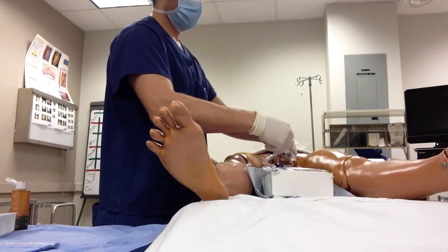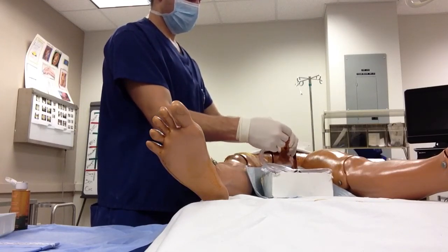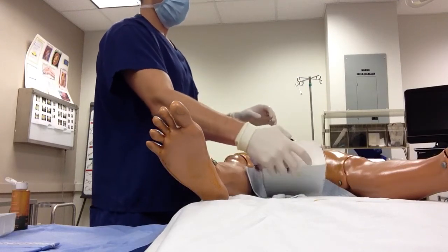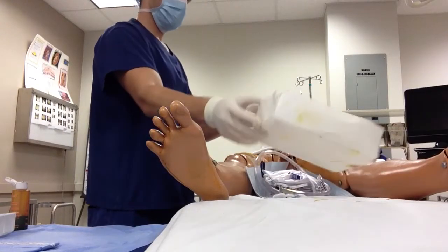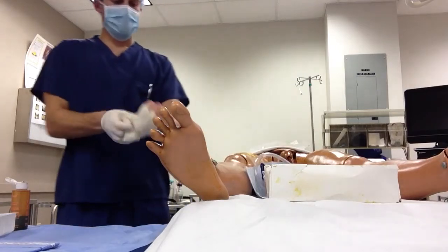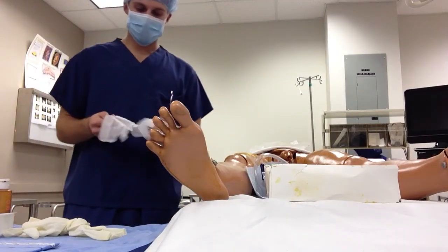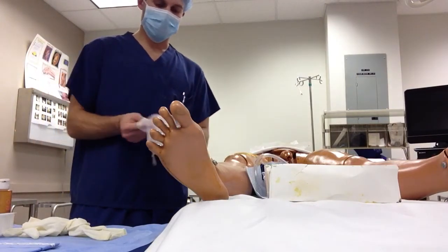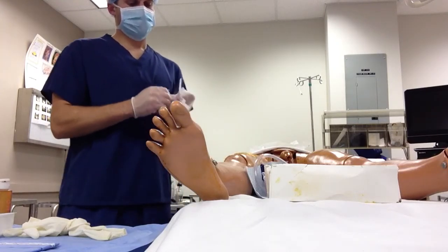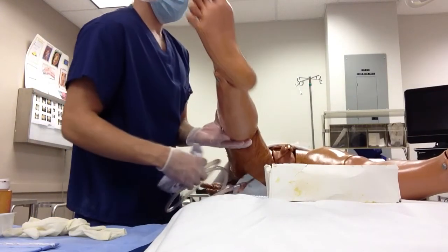Remove your syringe, pull back on the catheter, and it should get stuck in place. Then remove your sterile gloves. I keep another pair of non-sterile gloves to put on. Lift up the patient's leg, bring the catheter underneath, and attach it to the bed.